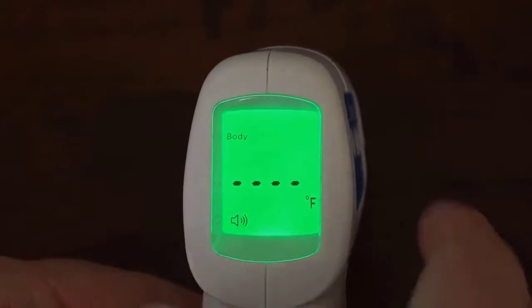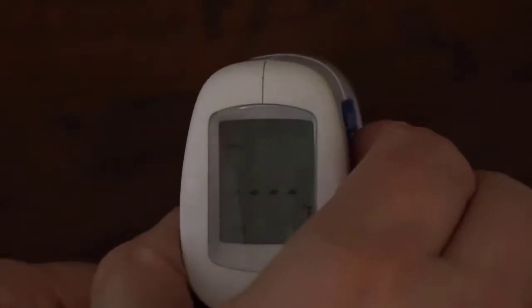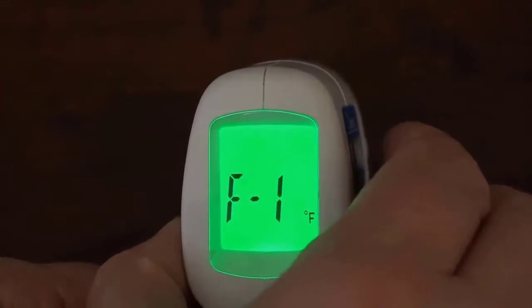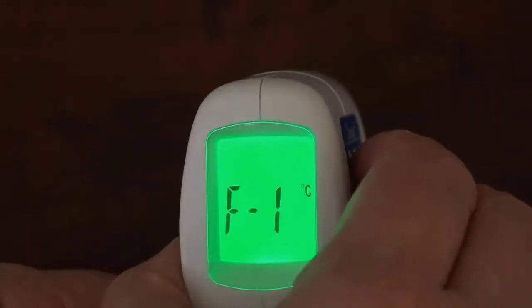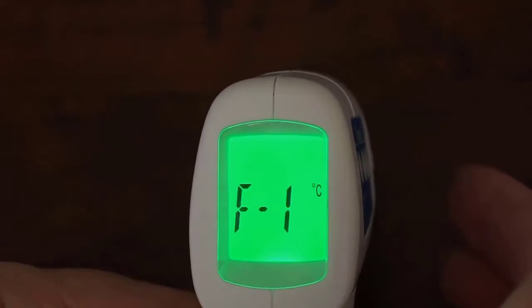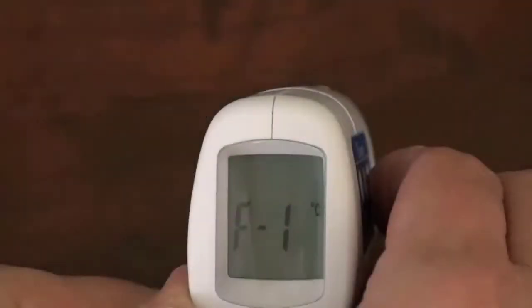Press and hold the mode button for two seconds. F1 is displayed. Single press the mode button to toggle between Fahrenheit and Celsius scale. Single press the mem button three times to return to the home screen.